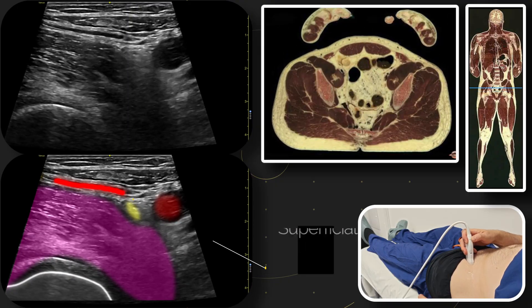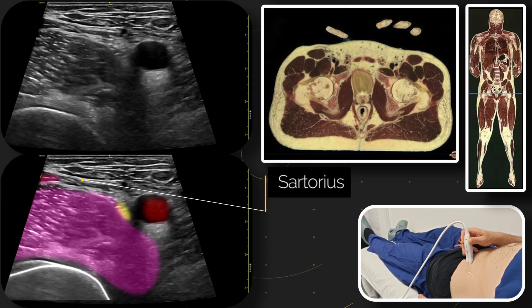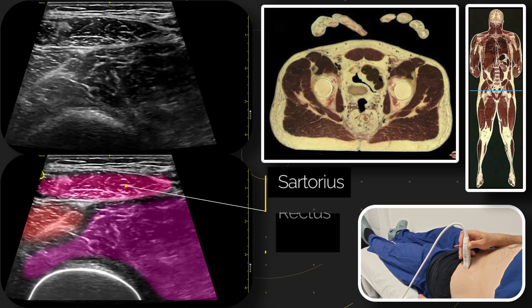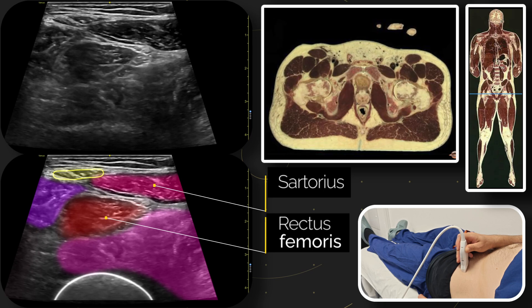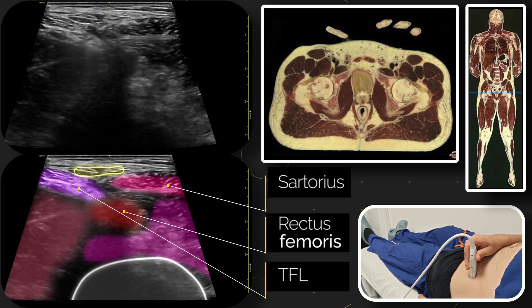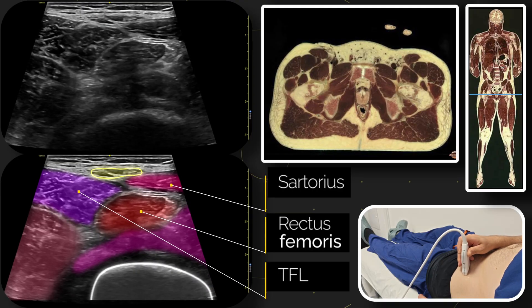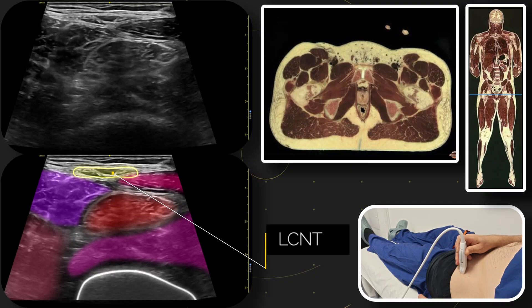Then we're going to slide our probe more laterally and look at four other important structures: the sartorius, the rectus femoris — which will change shape as you slide the probe up and down — and the tensor fascia latae. On the lateral aspect of the sartorius is another structure to look out for: a fat-filled tunnel that usually contains a variable number of branches of the lateral femoral cutaneous nerve of the thigh.